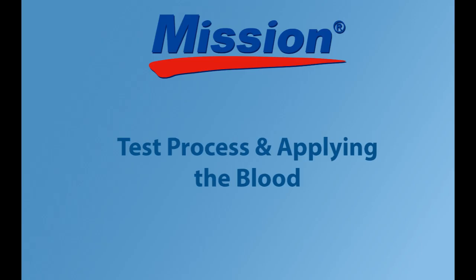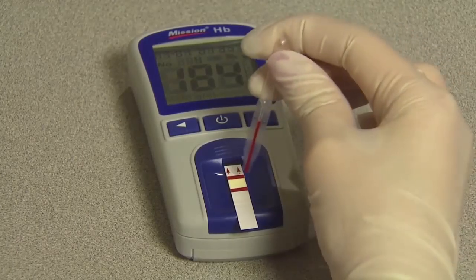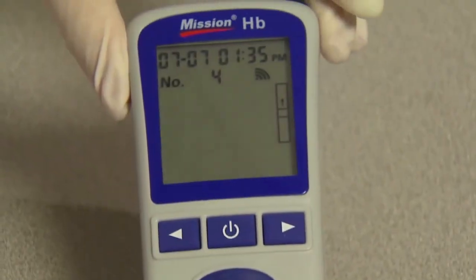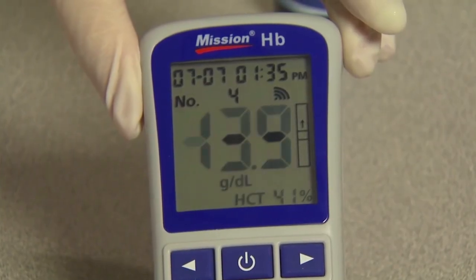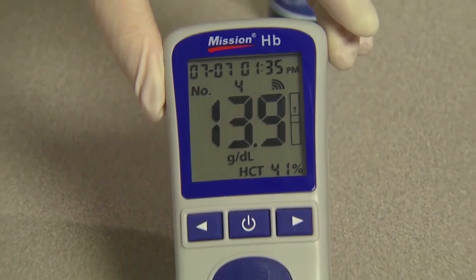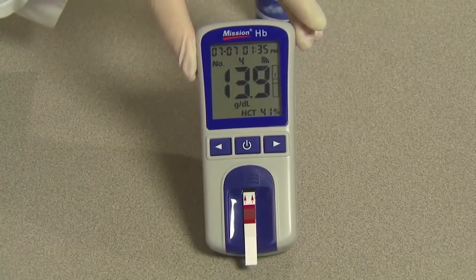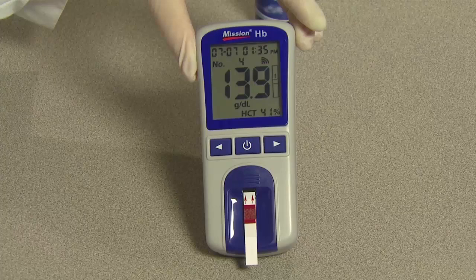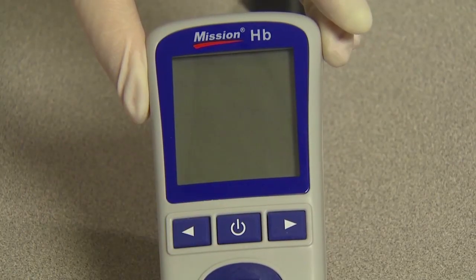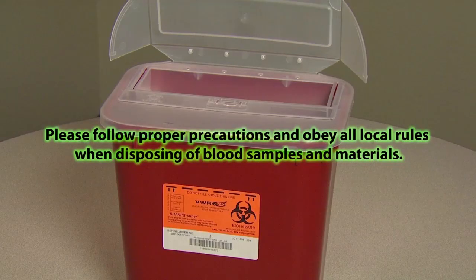Test processing and applying the blood. Apply the blood sample to the center region of the specimen application area of the test strip. The meter will begin testing automatically with three dashes in a line flashing on the display indicating the test is in progress. Results will be displayed in about 15 seconds with the HCT value displayed at the bottom of the screen. The meter will automatically turn off after eight minutes of inactivity or when the power button is pressed. Please follow proper precautions and obey all local rules when disposing of blood samples and materials.